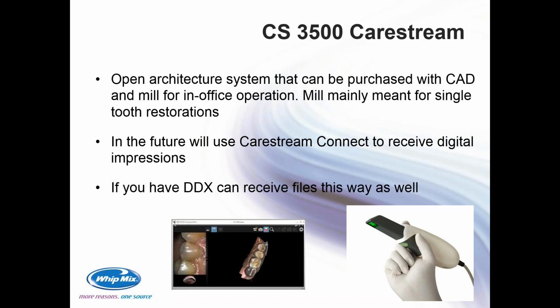However, they will tell you they have an anti-reflecting liquid or powder that may be necessary when you're scanning something that is uniform in dimension or highly reflective. So say a standard abutment may need to be sprayed. And then in the future, you'll have to use Carestream Connect to receive digital impressions. I don't believe that's up and running just yet. I'll touch on that a little bit later, a couple slides down. And then with them being an open system, you can use DDX to receive files from them as well, which is just a secure way, really, or any secure way to receive files from the Carestream 3500.